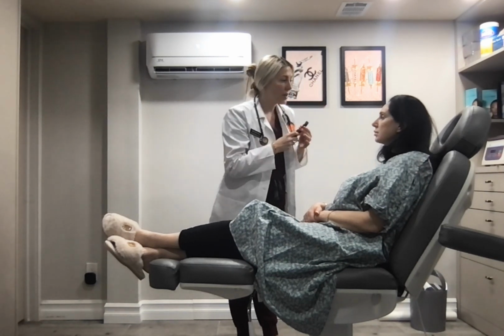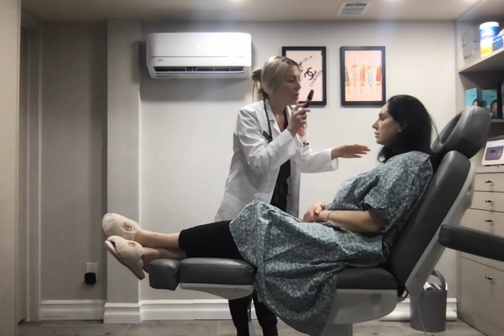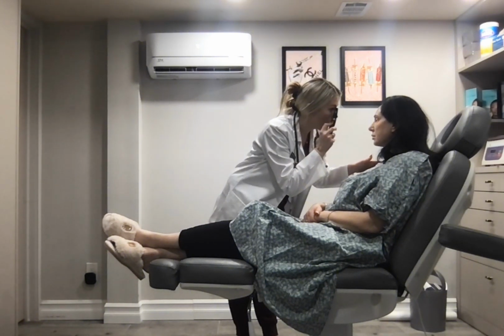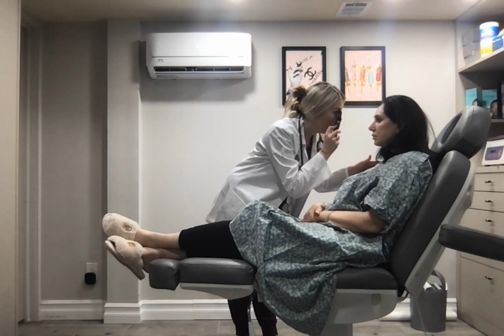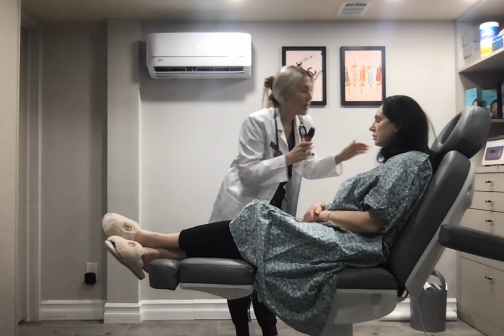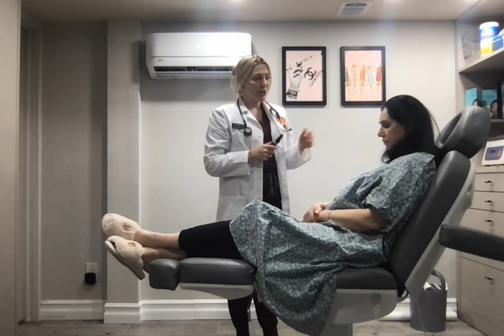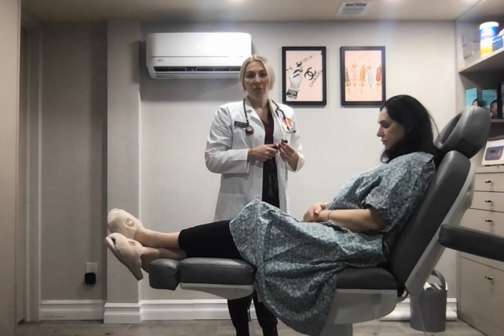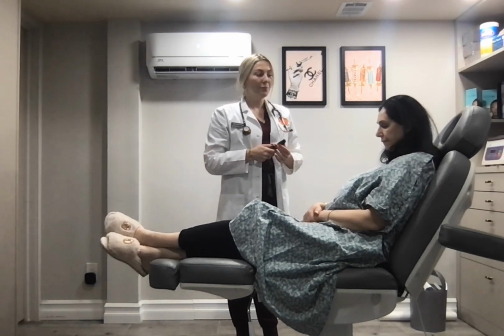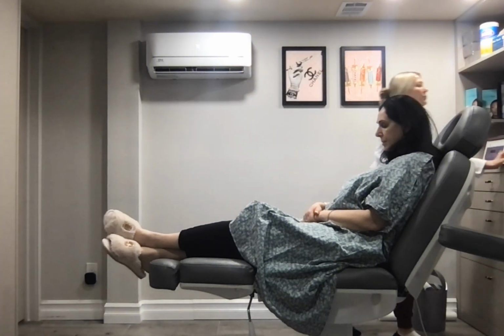And now I'm going to be looking at the retina, the vessels, and the optic disc to make sure that they are all normal. Okay, the optic disc is nice and sharp, edges are not blurred, vessels are noted, and there are no vessels around the macula either. Next, I'm going to be moving on to the ears.